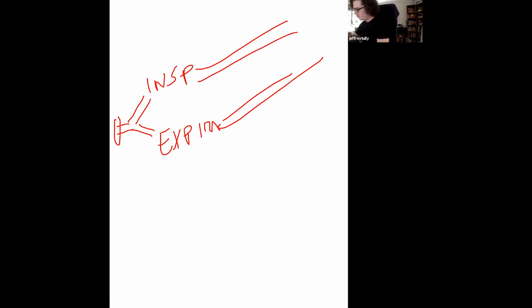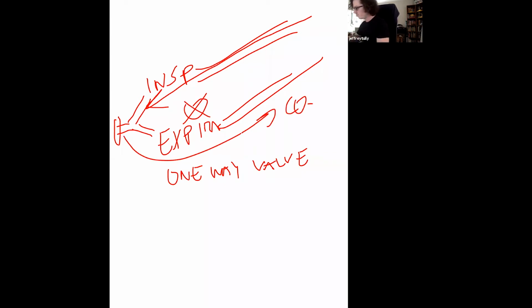During each cycle of inspiration and expiration, there are one-way valves to ensure that the push breath from the ventilator doesn't go into the expiratory limb, and when they're expiring CO2, it's not going to get into the inspiratory limb for them to rebreathe. If there is any sort of mechanical fault in that, such that they rebreathe CO2, that's obviously less than desirable.